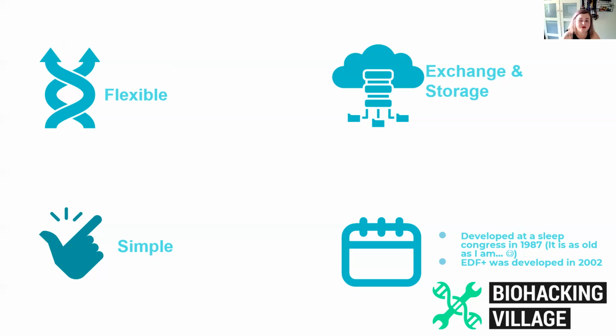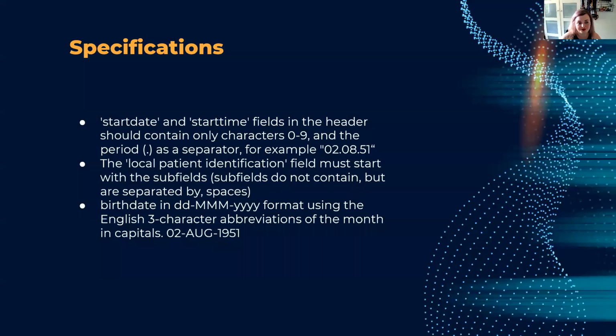An EDF file is also super flexible. It allows for exchange and storage. It's very simple to use and simple to write to. Some fun trivia about the EDF file is it was developed at a sleep congress in 1987. So it is as old as I am. EDF Plus, which was slightly better, was developed in 2002.